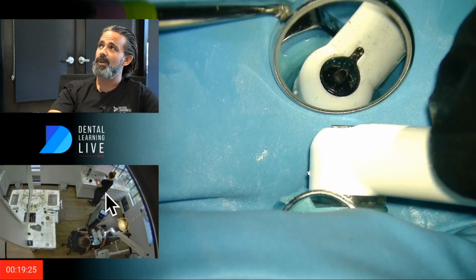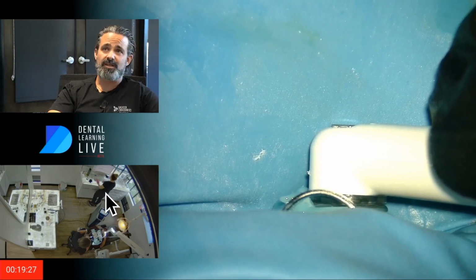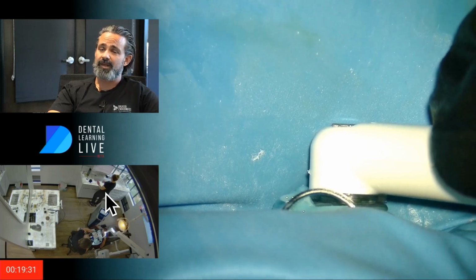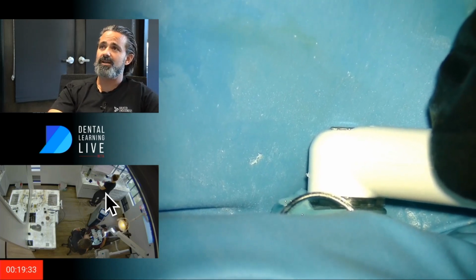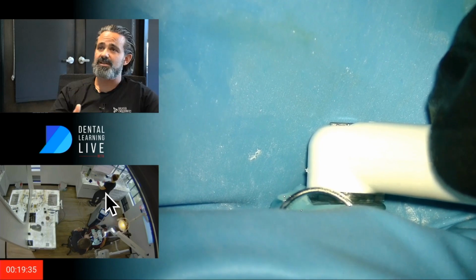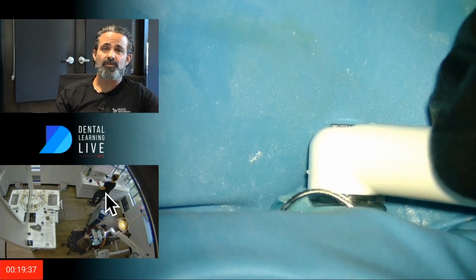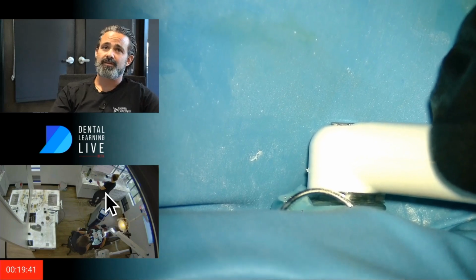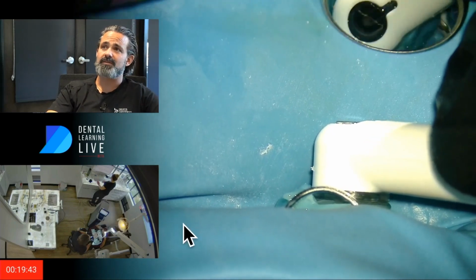So her goal during this little 8-minute cycle is to get everything done, everything saved, the final x-ray. That way we're really efficient, and we're trying to get everything A to Z done in under an hour. Really my goal is 45 minutes, to be honest. I schedule an hour because of anesthetic time and talking time, paperwork time, stuff like that.